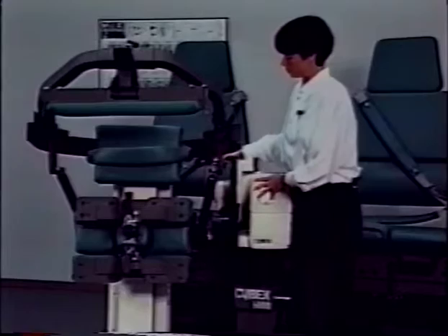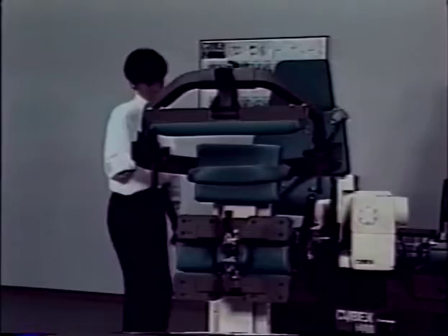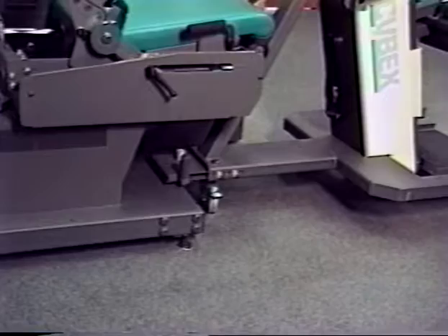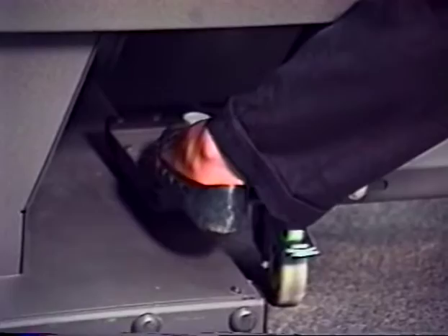Unlock the three caster wheels. Then pull the TEF modular component until it is in line with the Cybex 6000 seat. To disconnect the TEF modular component from the base of the 6000, move the hitch release bar towards you, and then pull the TEF modular component until it disengages from the post.